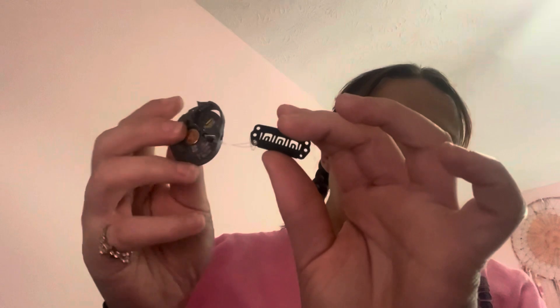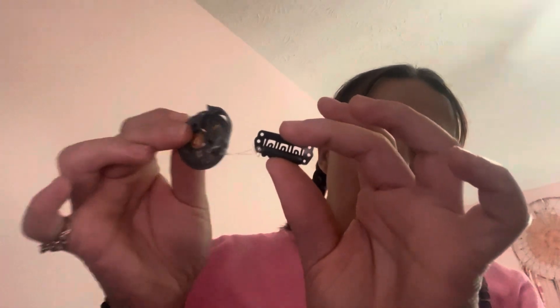Now for batteries — this is the battery that I have. I wear a size 13, and I have an X on one side and a blank space on the other side of the battery. The front side to put on is the X side.